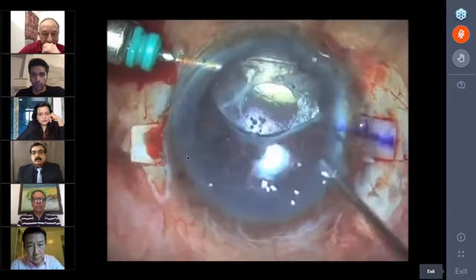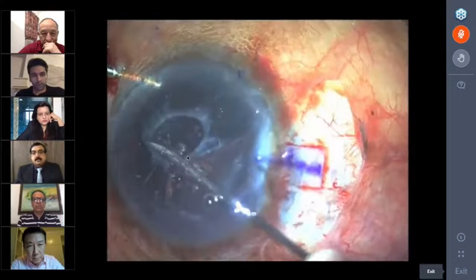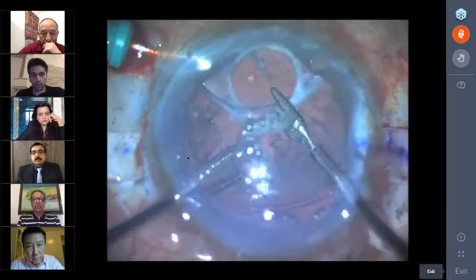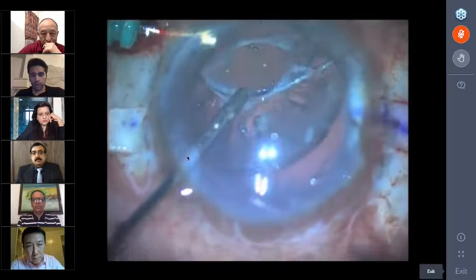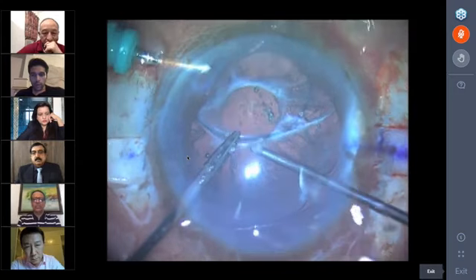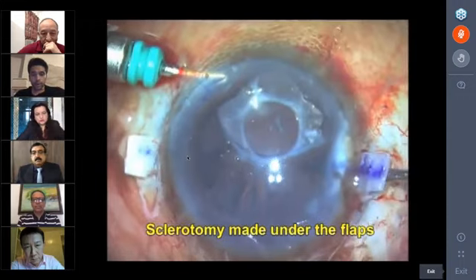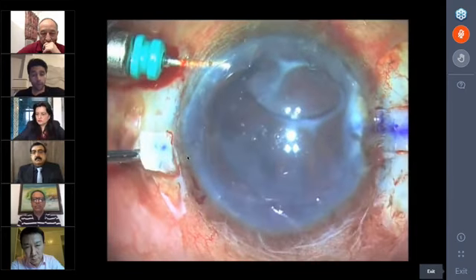Ensure that I'm free of any viscoelastic. I first tried to nick that bag and take it out, but I was not able to do so. So what I did is eventually hold the optic edge. But while I was doing that, if you see on the side periphery, there is a huge endocapsular ring on the periphery of the bag. So now I have to change my strategy, not just to glue the lens in, but also to remove that endocapsular ring along with the bag.